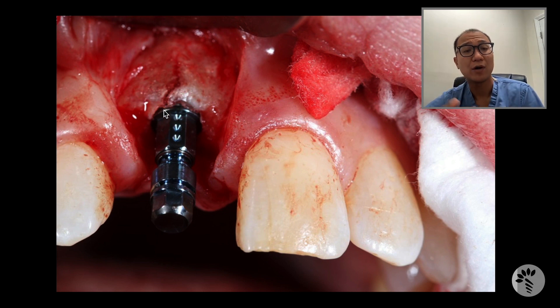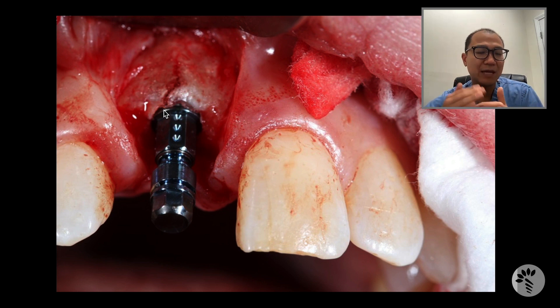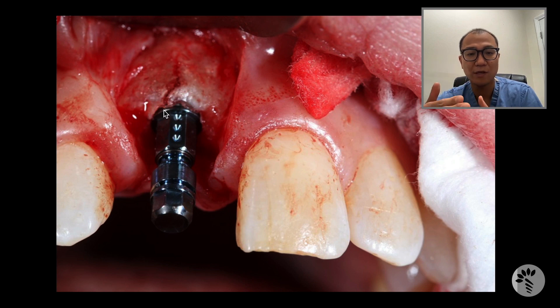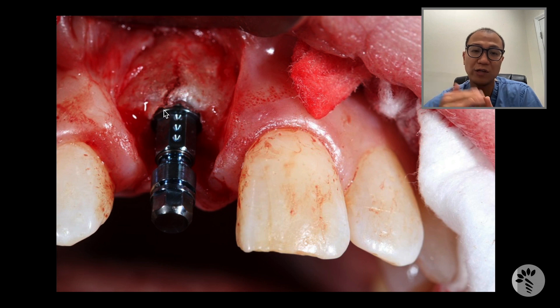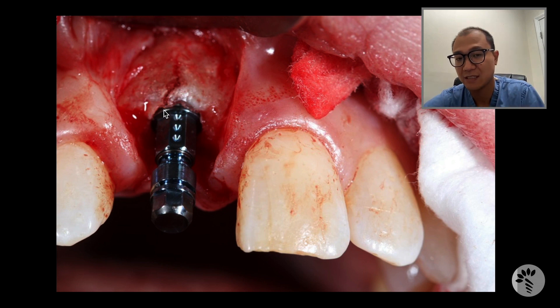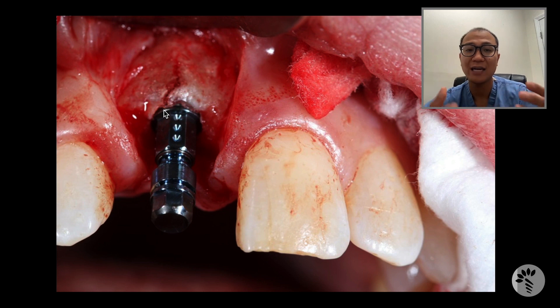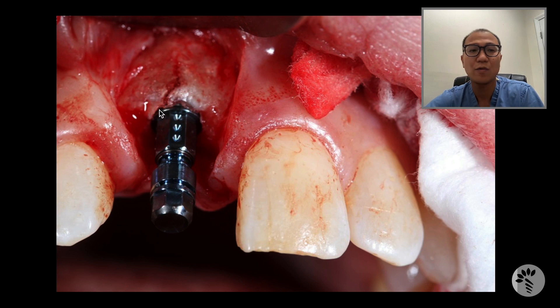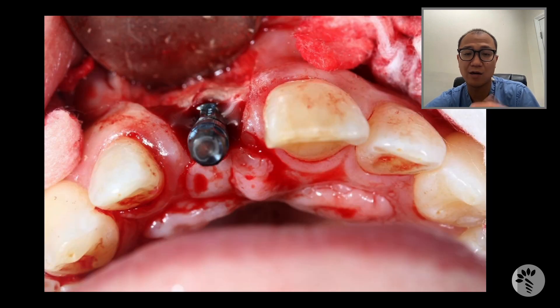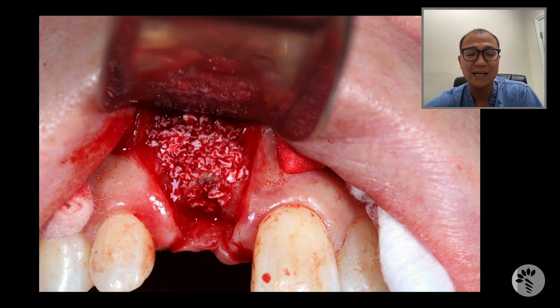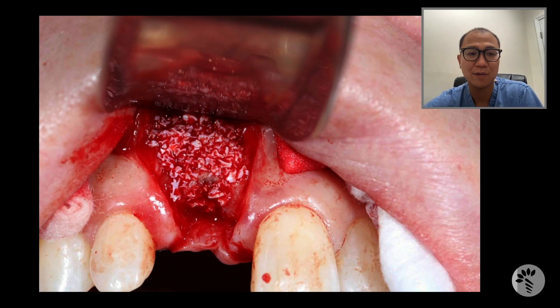What do I do? I want to protect that buccal plate. From the scientific literature, if an implant has more than two millimeters of buccal plate thickness, there is a reduced risk of causing gingival recession around a dental implant. Knowing that this is a highly aesthetic area, I want to minimize that risk. So after placing the implant in a prosthetically driven position, I added some xenograft to thicken the buccal plate in this area.